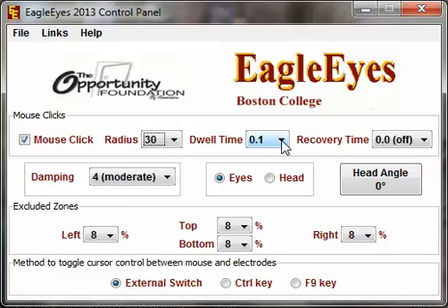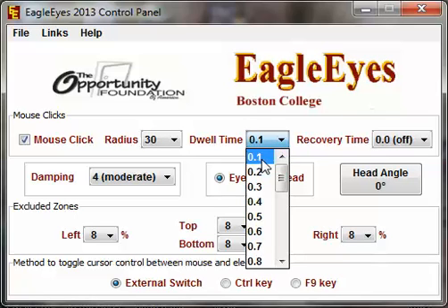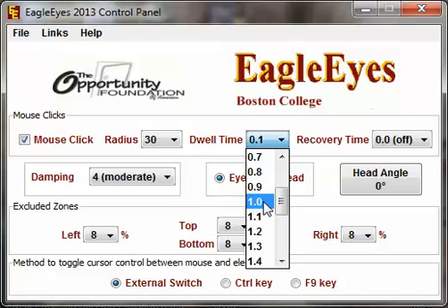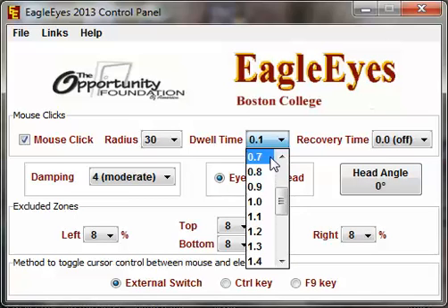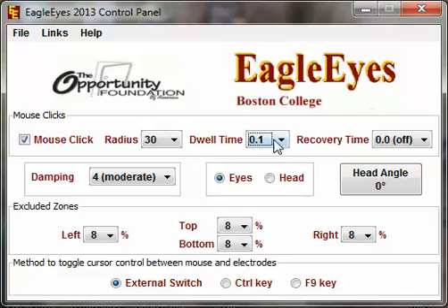The dwell time is how long they have to focus within that area to create the click. To start out, we want a low setting — a tenth of a second. One second is actually a long time to focus within a 30-pixel area to begin with. As the user gets better and is using smaller icons, a higher dwell time may be necessary to make sure they don't click the wrong icon, especially if icons are close together. Starting out, use a larger radius and a low dwell time to ensure the user has a good experience and enjoys EagleEyes.